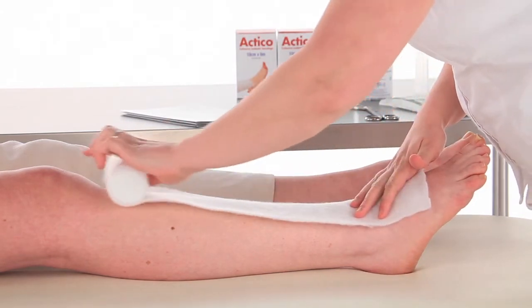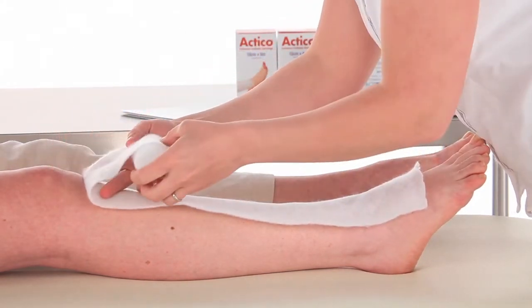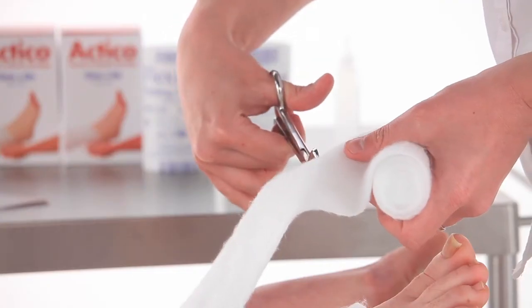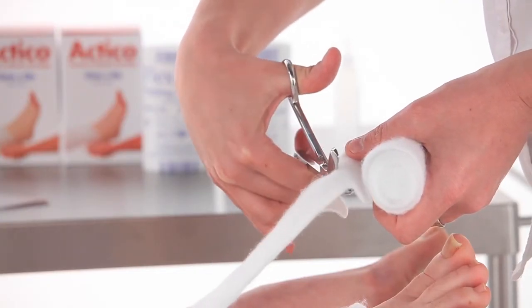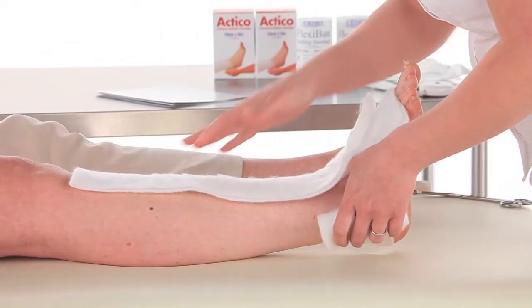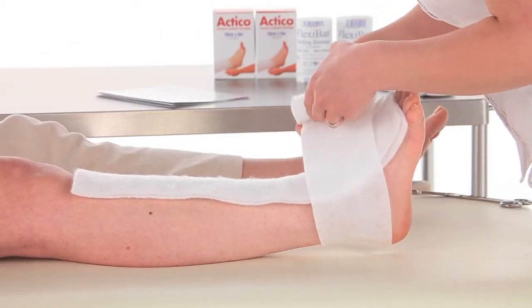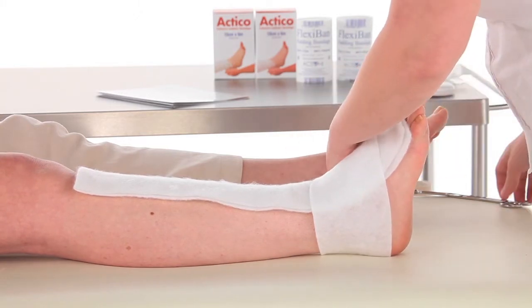For ankle circumferences less than 18 centimetres, apply enough Flexiband padding to bring the ankle measurement between 18 and 25 centimetres. Measure the ankle, then reshape and protect the limb if necessary by applying Flexiband padding.